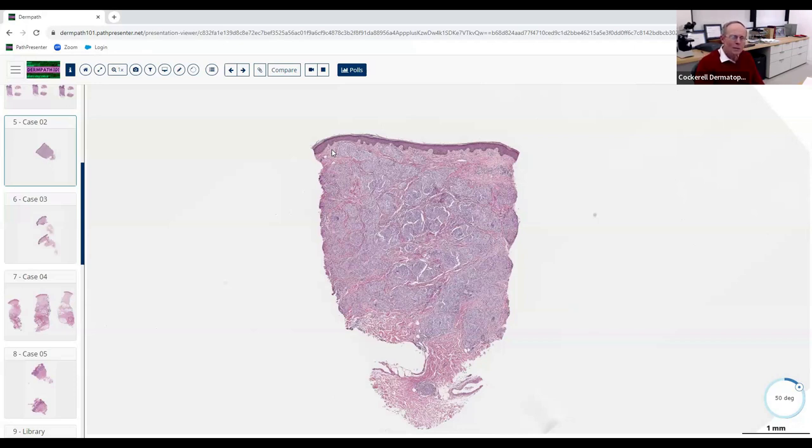Is granulomatous a pattern itself, or a subtype? More of a subtype — correct. So what's the actual pattern here? It's perivascular only? Is it just superficial perivascular? No — it's more diffuse. Very diffuse — notice how the virtually entire dermis is involved. Many granulomatous disorders don't give you that diffuse involvement, so that's a helpful clue. These are histiocytes predominating — nodular and diffuse.